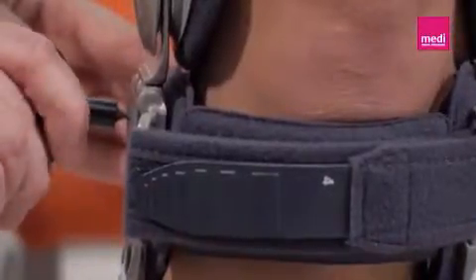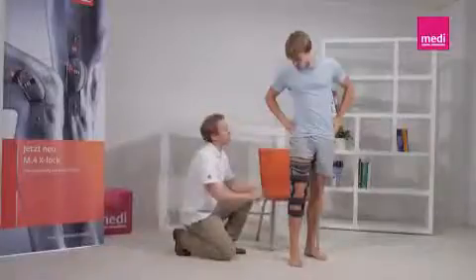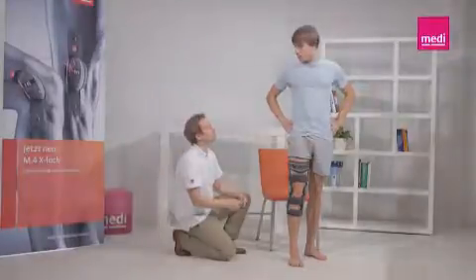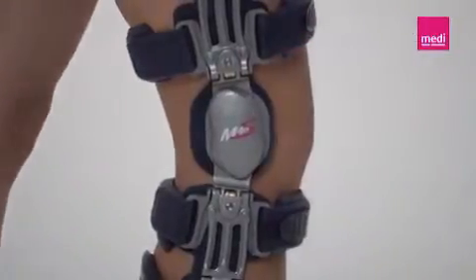Make sure the orthosis has been applied properly. For conservative treatment, the orthosis should not be worn for more than 2 hours a day. The orthosis can then be worn for longer periods depending on how well the patient tolerates it.